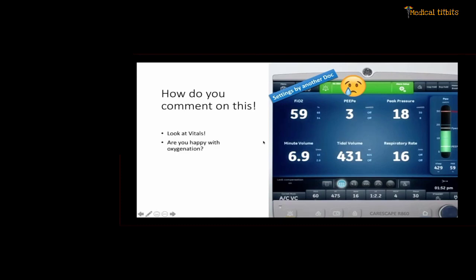Okay, again, you look at the vitals. The question is whether you are happy with the oxygenation. Okay, if the patient is not at all in pulmonary edema, lungs are preserved, not flooded at all, then probably 5 centimeters of water PEEP might do. How does PEEP help in oxygenation? We'll come to that. And again, you have to be cautious with PEEP because in congestive heart failure, you need to maintain the hemodynamics as well. So the PEEP can adversely affect hemodynamics if the PEEP value set is higher.